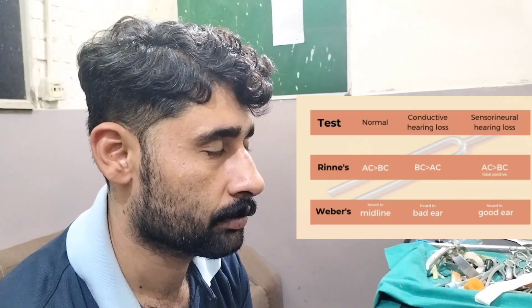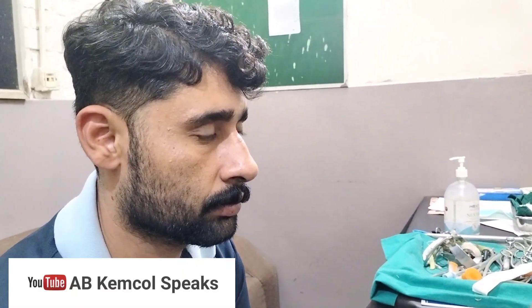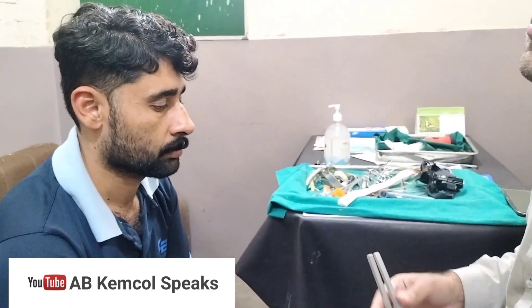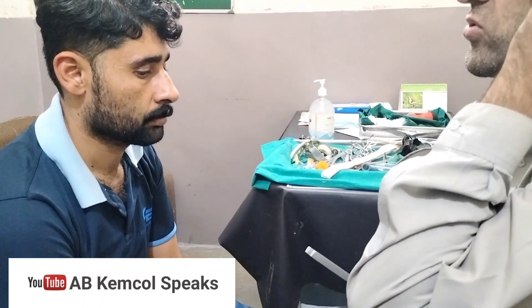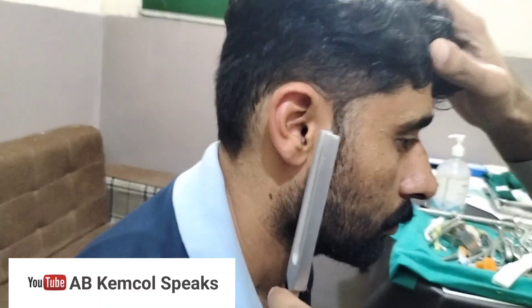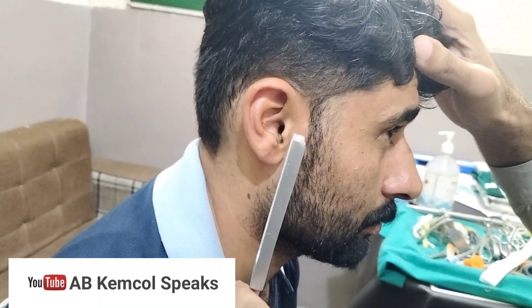Proceed with physiological tests of the ear. The most common test is the hearing assessment. The first test is Rinne's test. There are two types of Rinne's, but proceed with the quicker version: first explain the procedure to the patient, then strike the tuning fork against your elbow, place it on the mastoid, then in front of the external auditory canal, and ask the patient which position was louder.